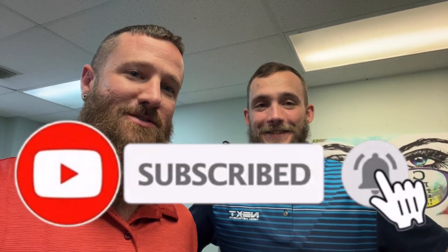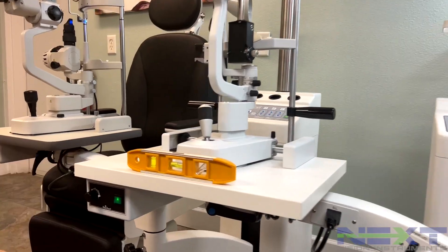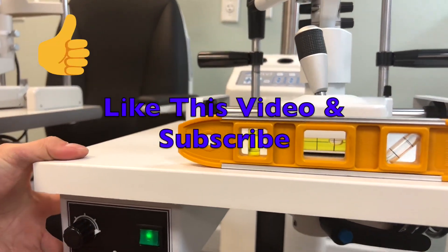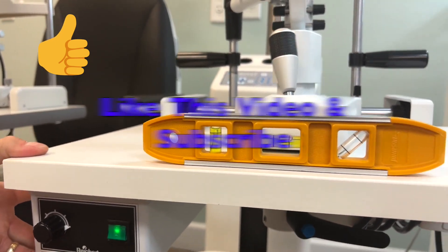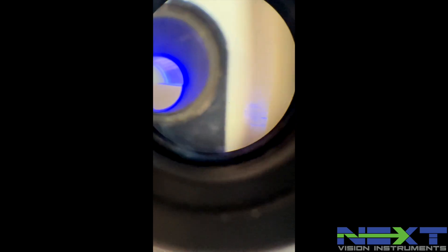This is Chad and Ethan with NexVision Instruments, and this is a brief video showing you how to level your slit lamp and align your tonometers. You can see ours is pretty unlevel and the prism on the tonometer is off-center.